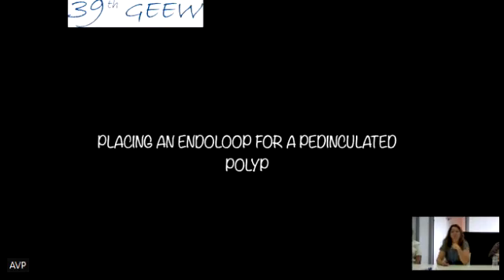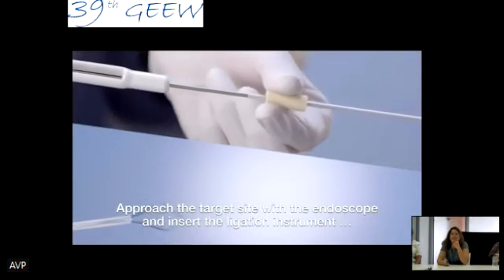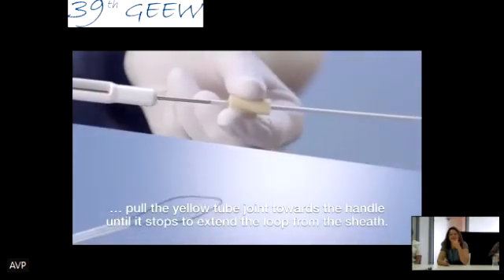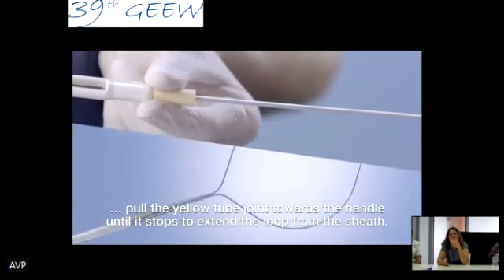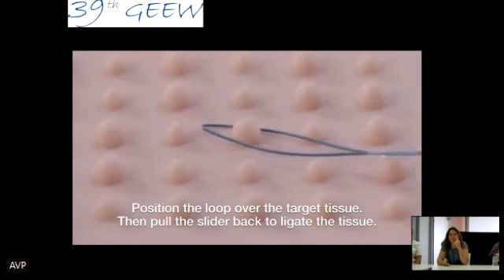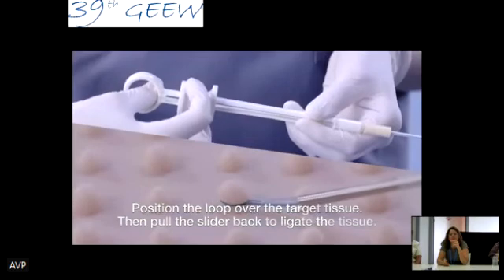So this is the endoloop. This is really your moment. This is when the loop is inside, and with a yellow tube, you can bring it inside, outside. You position it over the target tissue. You bring the slider back to ligate it.